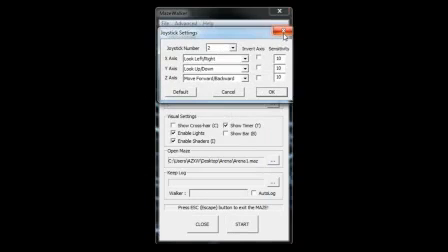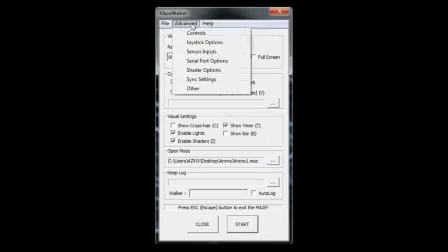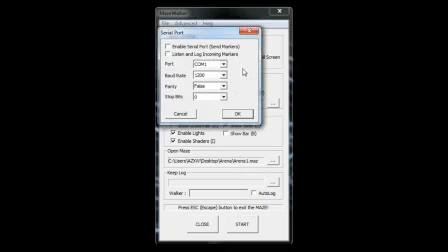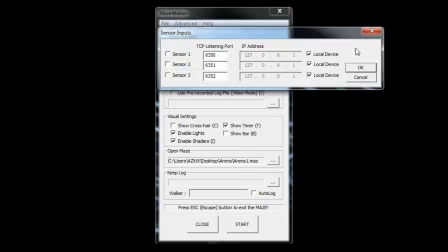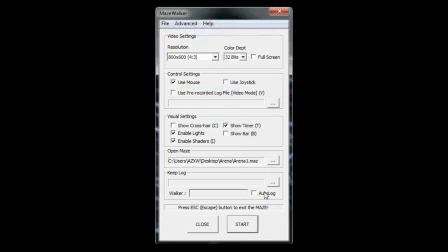External devices can engage in two-way communication with Maze Walker, gathering information or triggering changes within the environment. Device communication can be handled over TCP/IP or serial cable and can interface with a wide variety of devices including EEG, fMRI, and fNIR. During sessions, Maze Walker would log the subject movement along with any events that occurred during the session.